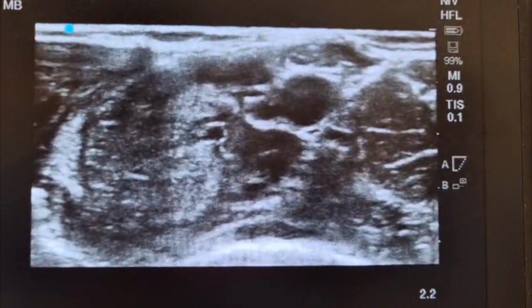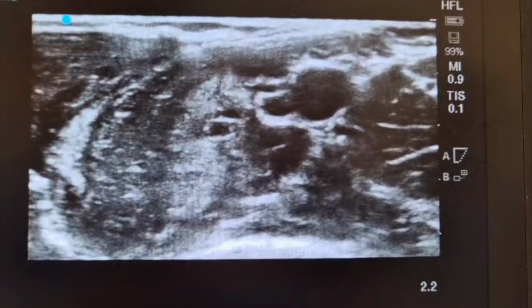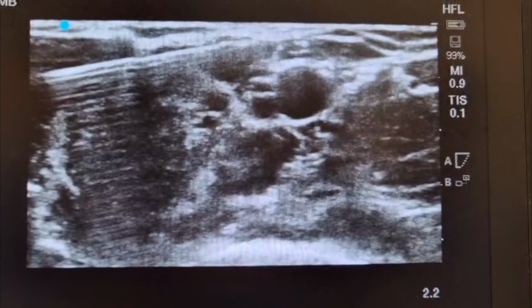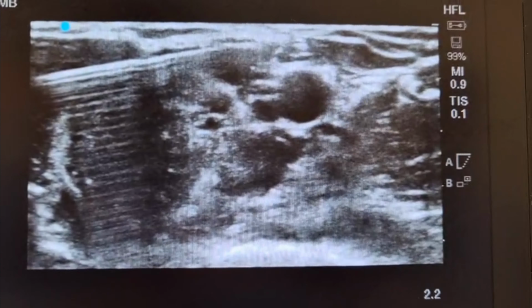Okay, go ahead. If you can scan slightly and get the needle in full view. Yeah, that's a bit more down. Yeah. Can I see the tip of the needle? Scan a bit. Yeah. So also we can wriggle it. In case you can't see, the best thing is to wriggle. Okay, wriggle. And you could see that nerve, the other one, lateral cord, ulnar nerve, is basically getting pushed down.